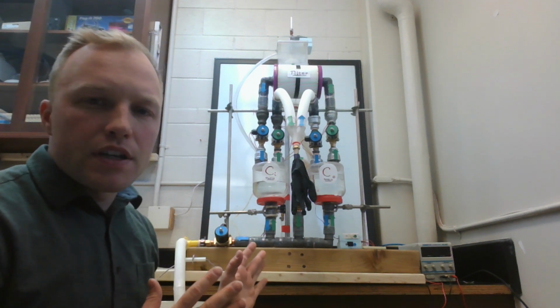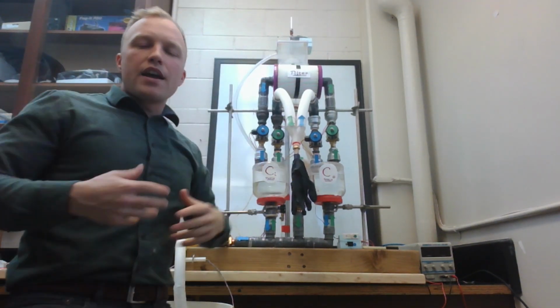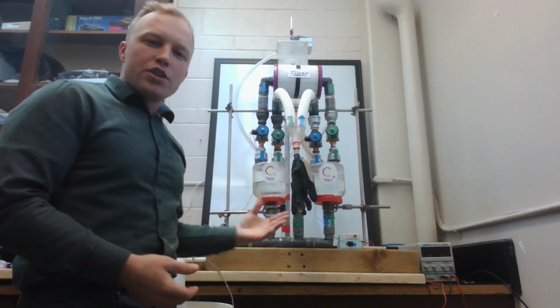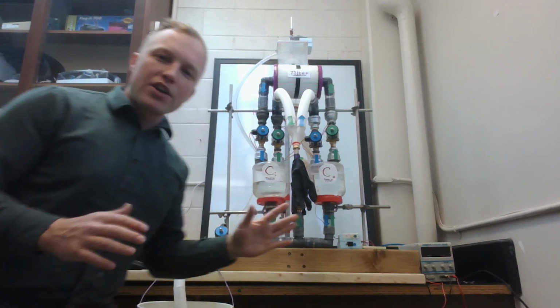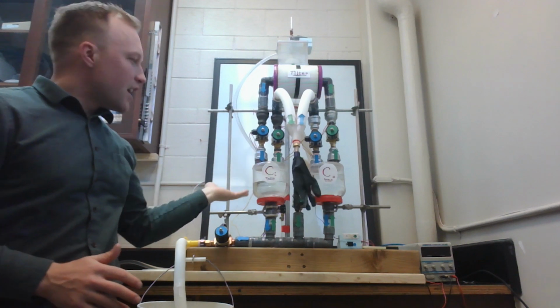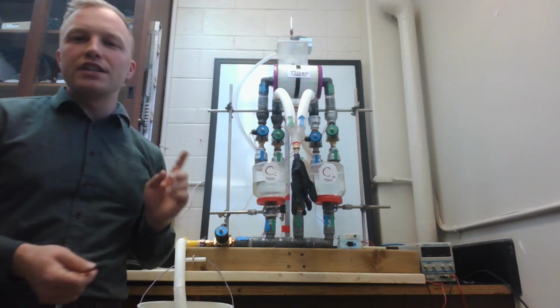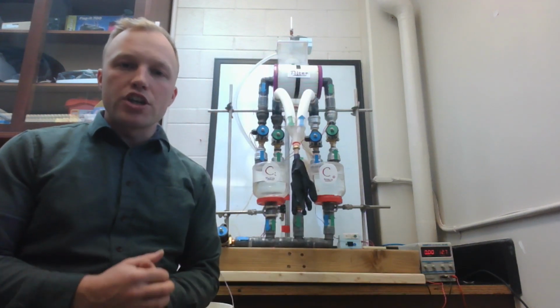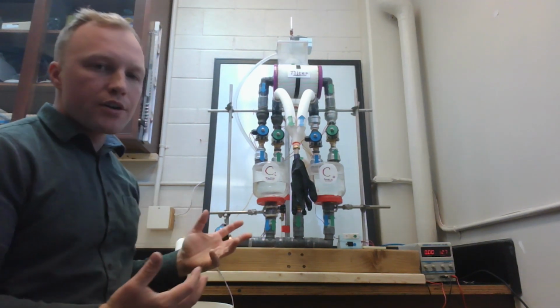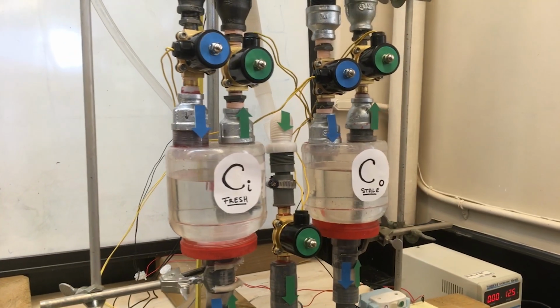So my first take is this. We have a cistern at the top. The cistern fills with water, and that provides gravity-powered pressure to our cylinders, and those cylinders then provide pressurized air to the lung. So the pressure of water due to gravity on these cylinders is what's actually driving the in-breath. This machine gets hooked up to a garden hose, so it needs a water supply, and it needs a small electrical supply. Something like a 12-volt power supply, a 12-volt battery, car battery, that kind of thing would do just fine. What we have here is essentially two cylinders that are controlling the inhale and the exhale of the body.